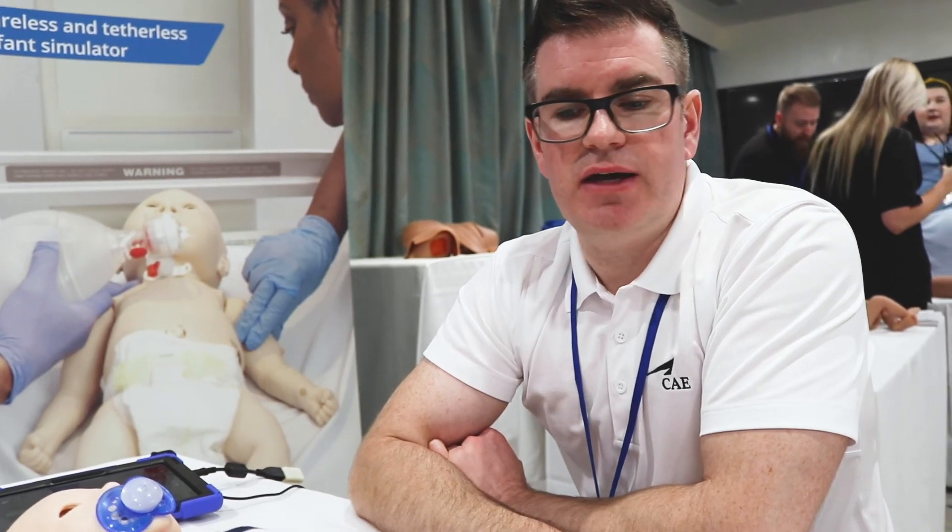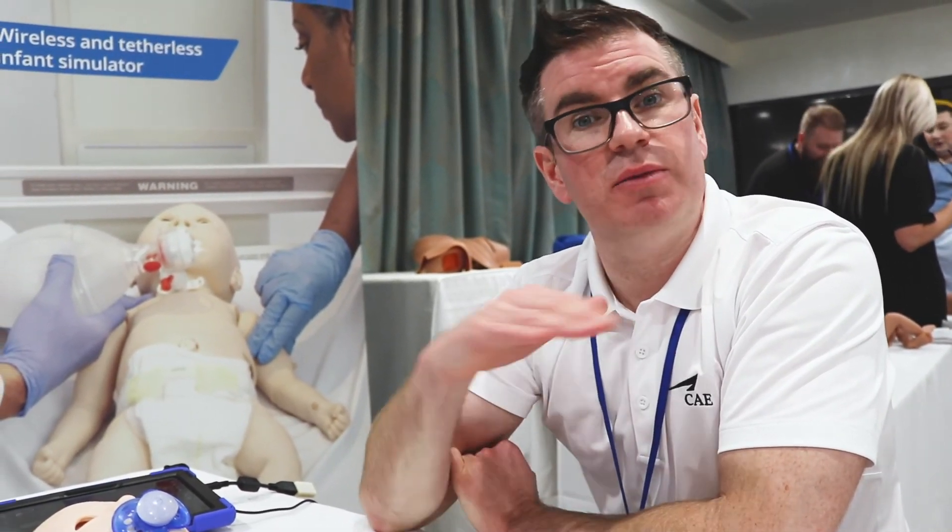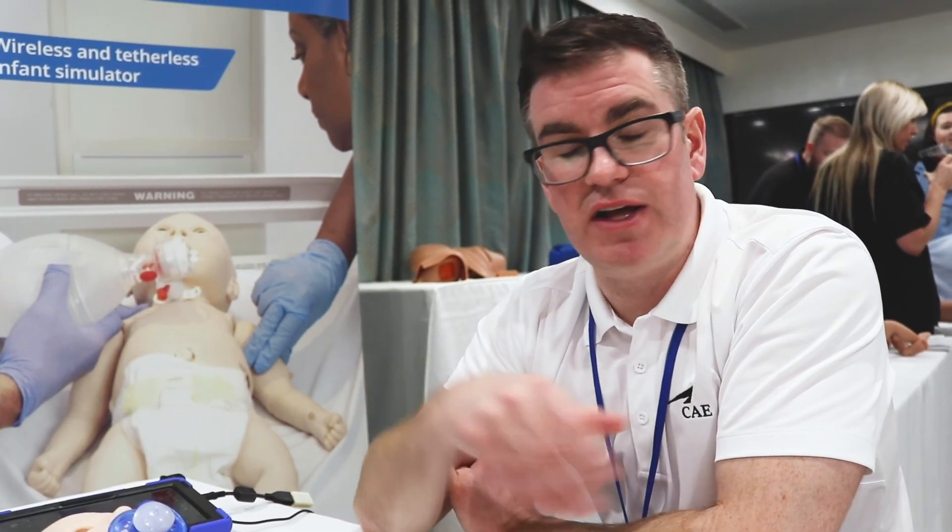Luna is available now in the UK. If you'd like to see any of the three models — the base model, intermediate model, or advanced model — please get in contact with CAE and we'd be more than happy to bring it out to you. Thanks very much.